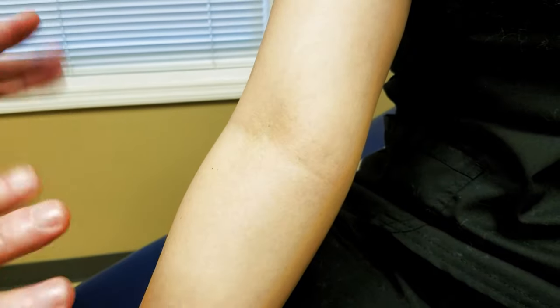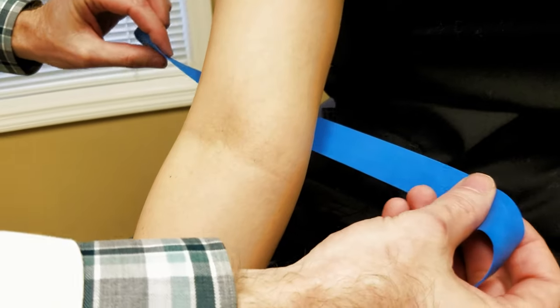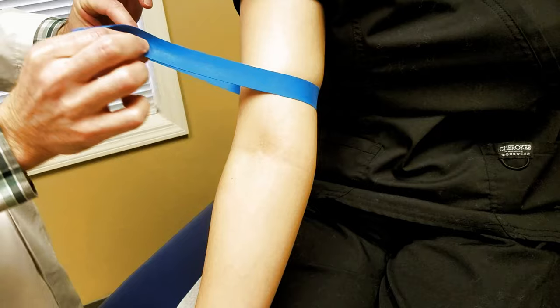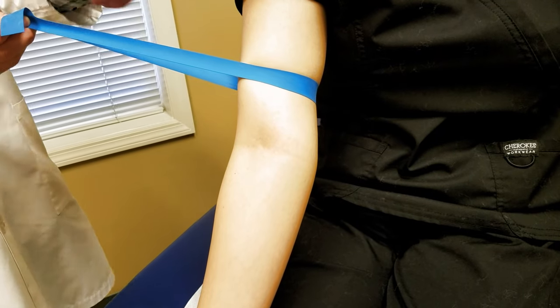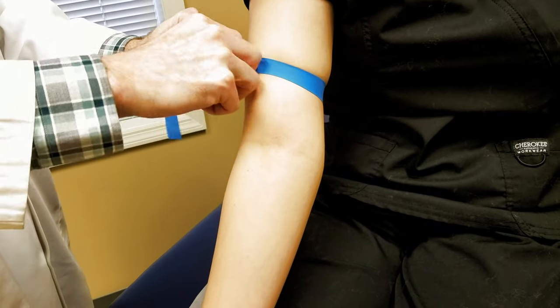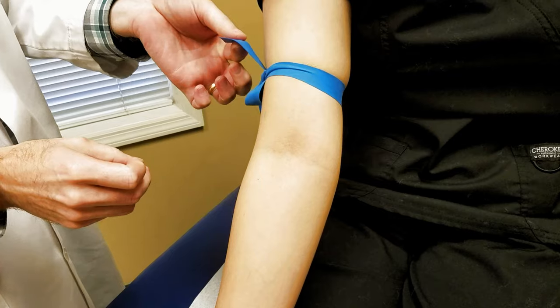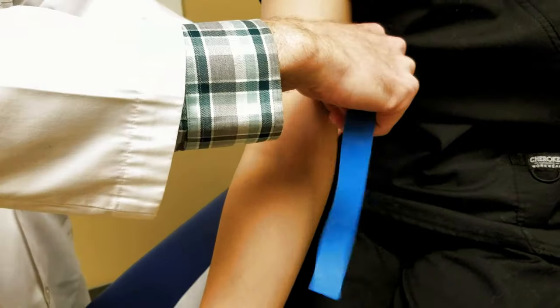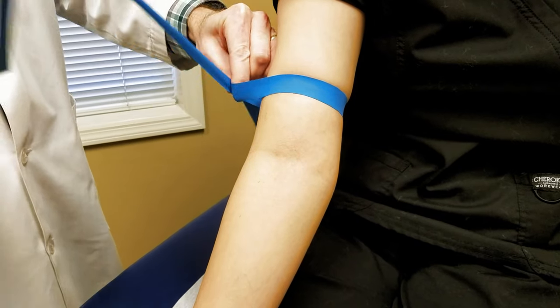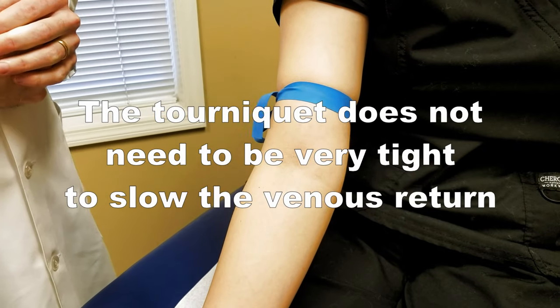Next, we're going to put a tourniquet on. My favorite way is to hold it like this, pull out, then cross over, then down low, reach back in through this way so it's under tension, and leave it like that. You want to leave this end out so you can just pop it off when you're done. So: cross over, pull out, stuff it back in there, and leave it like that.